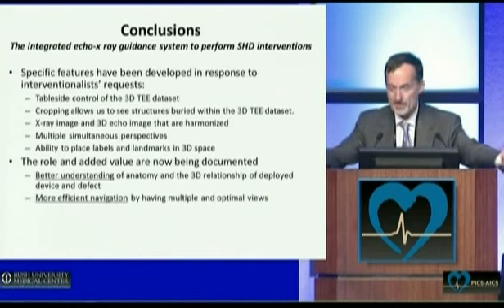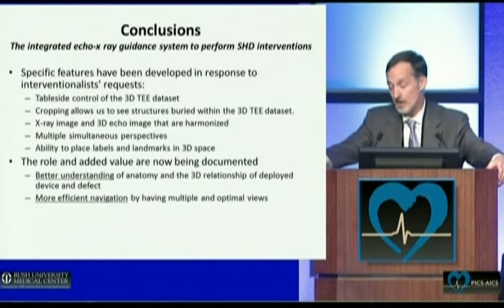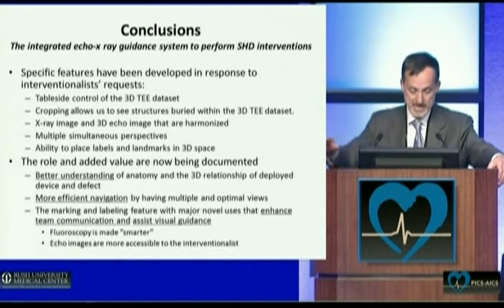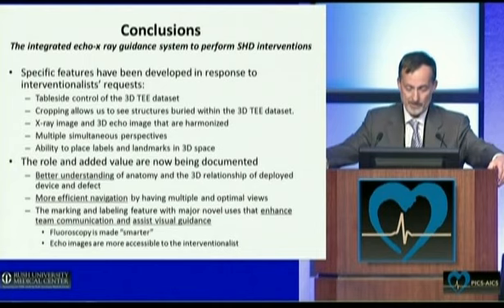You know, we're navigating in 3D open space in a lot of these, and using a 2D imaging modality, be it fluoroscopy or 2D echo, is passé. And it really allows us to communicate better with these team-based procedures, and that is a key enhancement. Thank you.